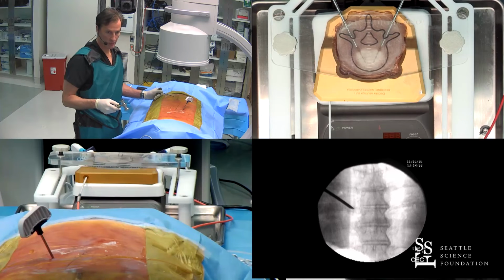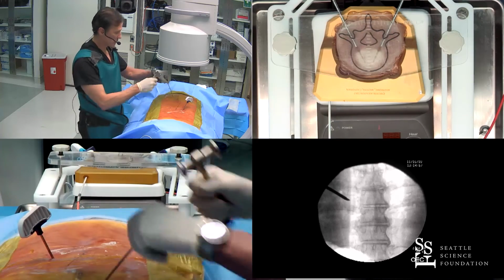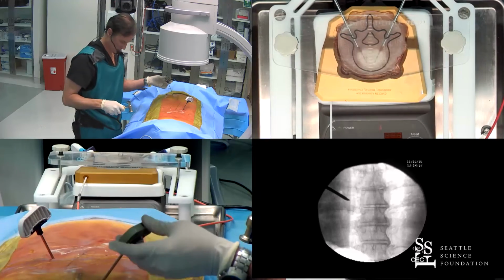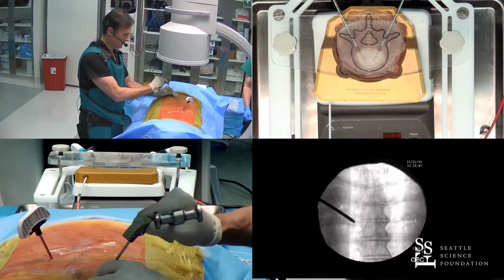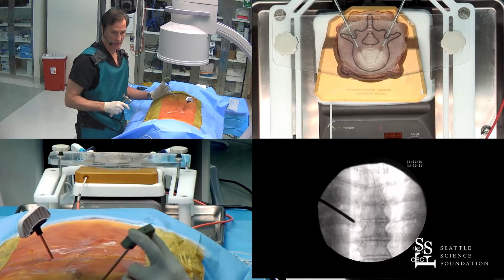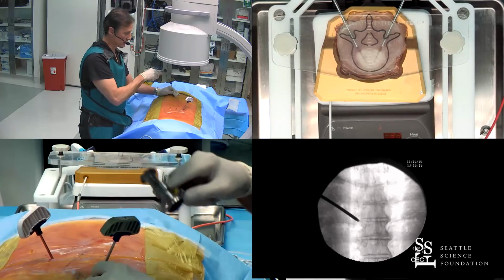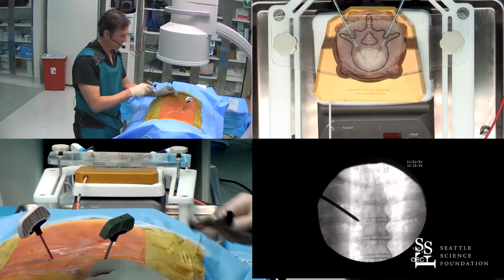So here's a nice level. We'll start up and out. And again, on that line, I won't draw it, but ipsilateral superior to contralateral inferior vertebral corner. We'll start here. And so I can feel the rib already. I can feel the back of the rib, and that will keep you out of trouble. And so I will steepen it up, turn the direction of the needle opposite so I can get some bite.